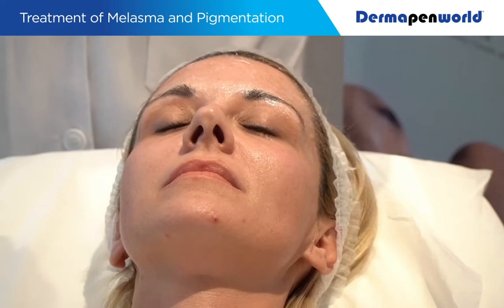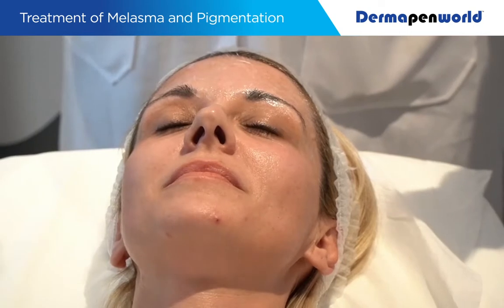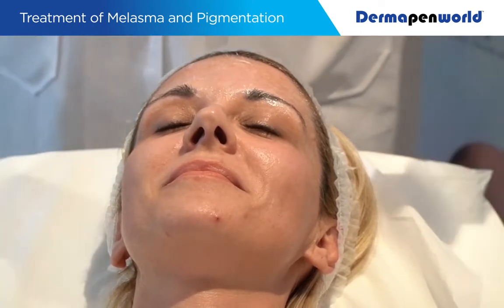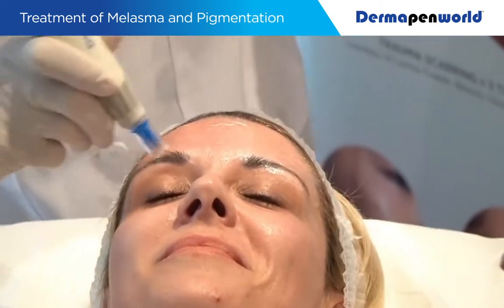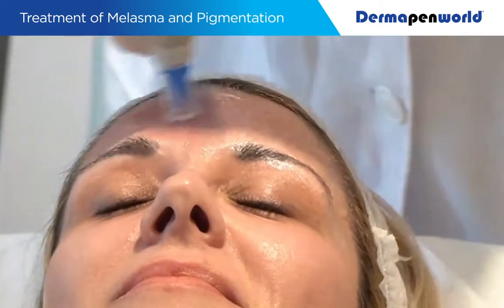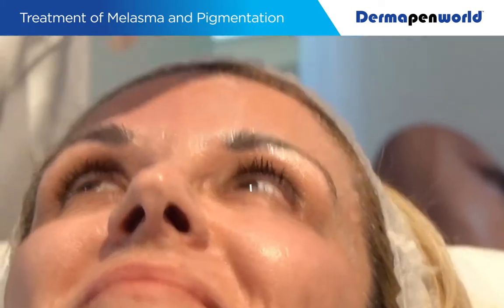So 0.4. So from Bangkok traffic, Athens, open road, Monaco. So working up 0.4. So vertical, vertical, vertical, horizontal, horizontal, horizontal. The skin is going nice and red for me. First diagonal, second diagonal. Now let's have a look. Perfect. So the occasional little pinpoint blood is coming out. Exactly where you need to be.